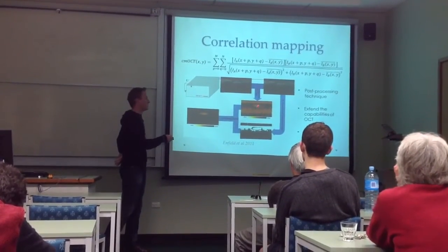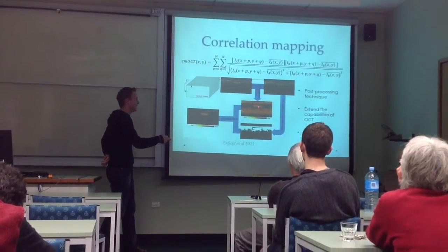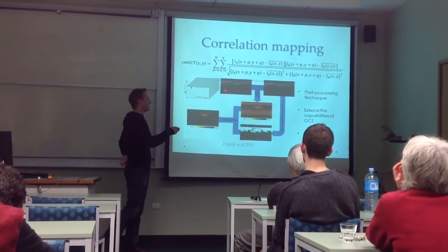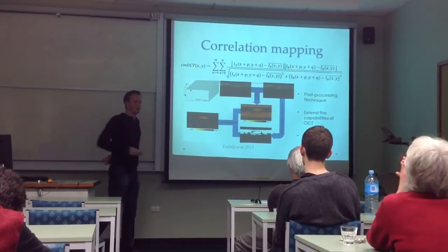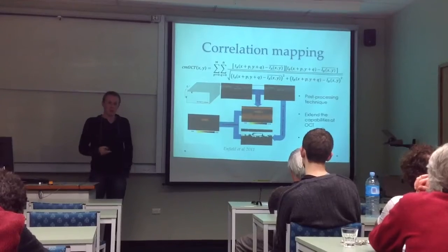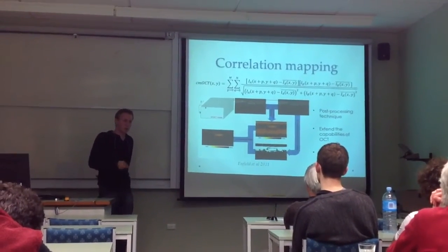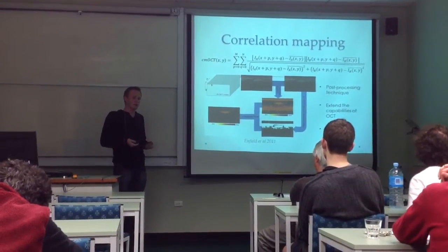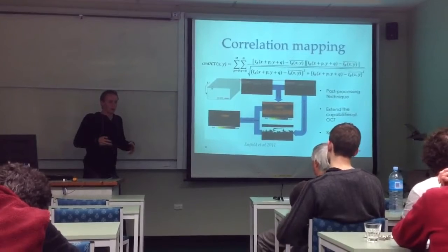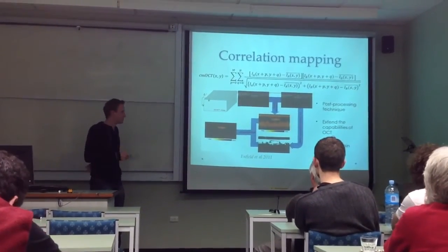So when you take the correlation, low correlation is light in this case, which gives you your blood vessels, and by creating a structural mask, you just get your blood vessel out, which allows you to just map the microvessels within the skin. So I'm going to try and combine that with the optical clearing and map the diffusion front moving through the tissue, hoping to show more structural detail about the density of the tissue at different areas.